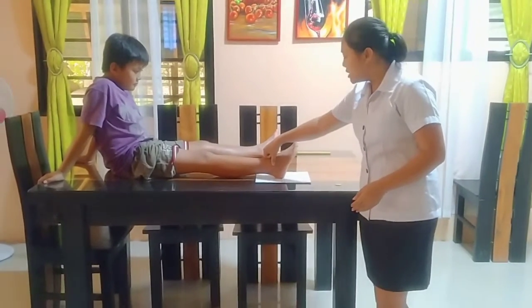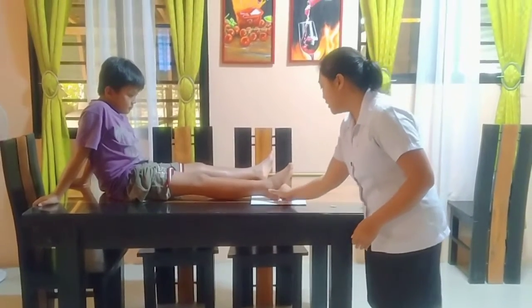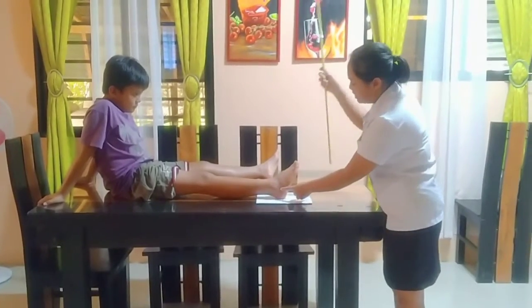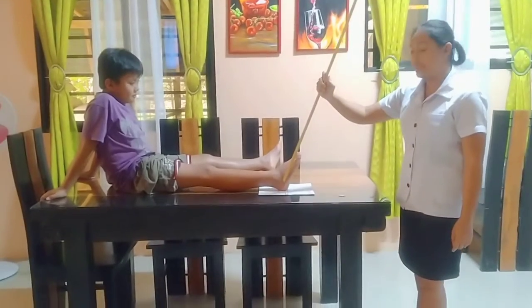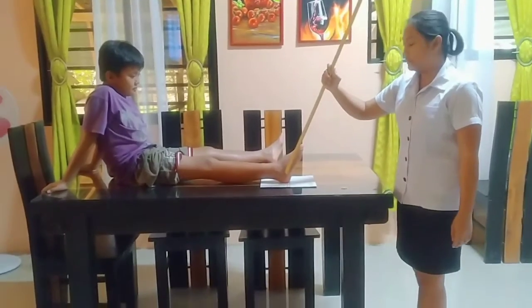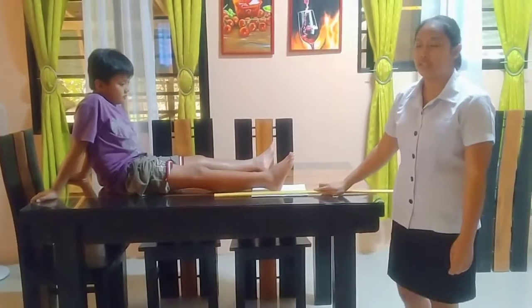Now, the central ray will be 1 inch distal to the malleolus and 1 inch anteriorly. So, pointing here, this will be the central ray, but we will be using angulation of 10 degrees through the said region. Now, this projection shows the middle articular facet and the mid-subtalar joint.